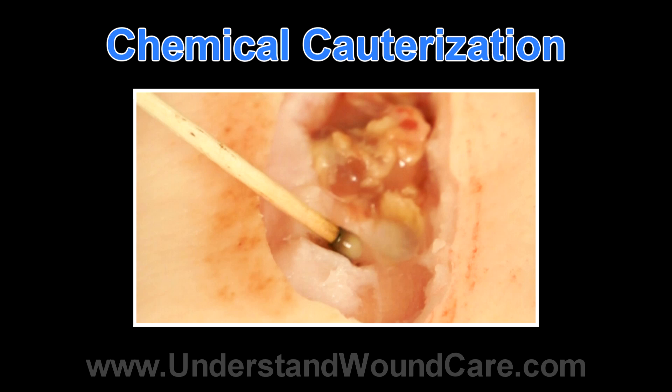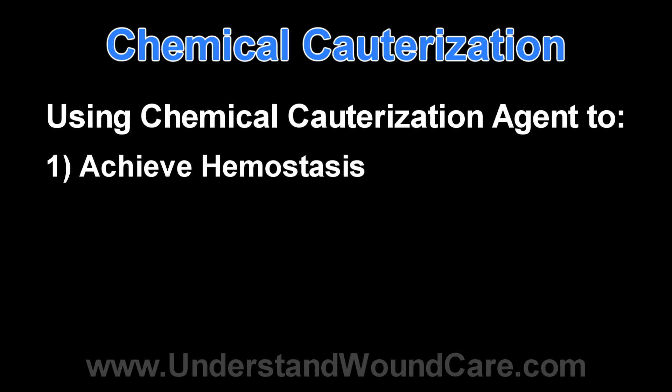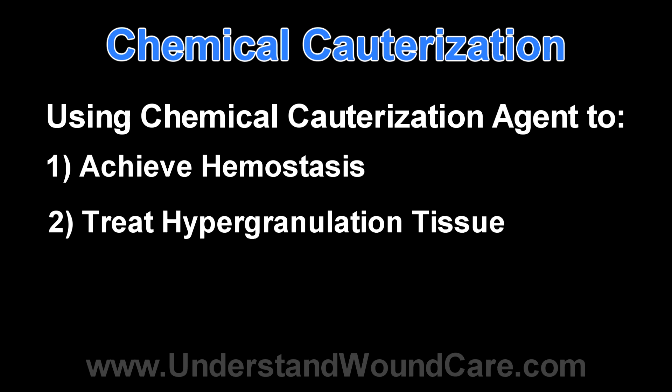In this particular demonstration, we will be using a chemical cauterization agent to achieve hemostasis in a wound that is bleeding after debridement. Additionally, we will also demonstrate how to apply a topical medication, in this particular instance a chemical cauterization agent, to decrease hypergranulation tissue that has occurred in a wound to promote correct wound healing.